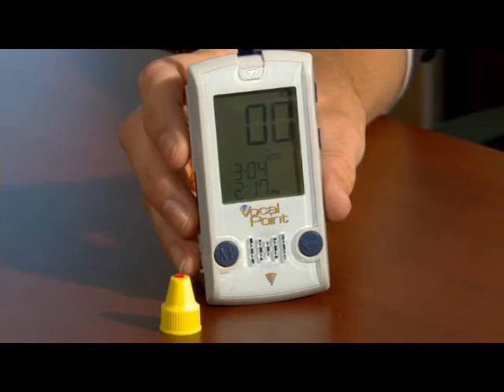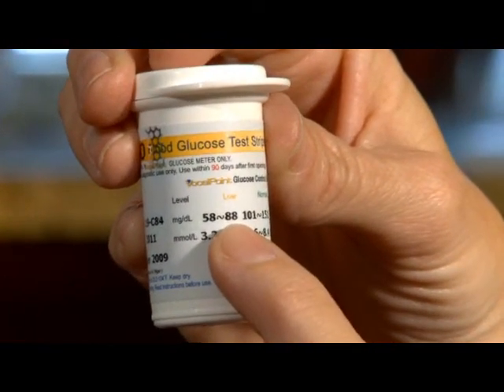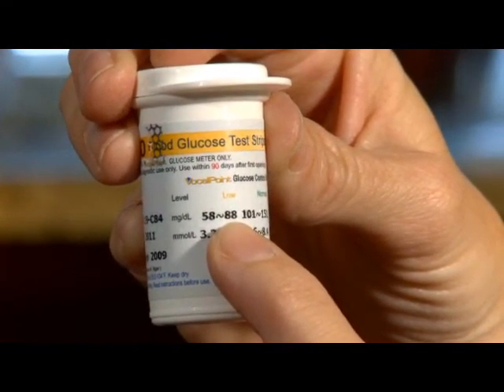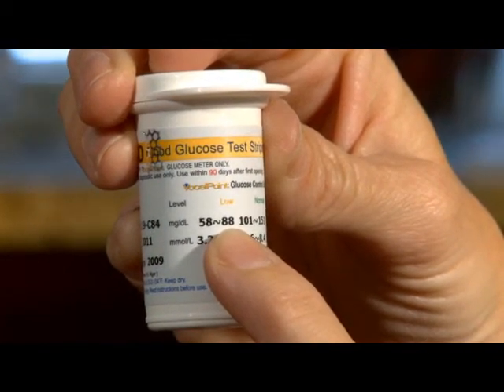The meter will count down from six seconds to zero and then will display the test result. Verify your control test results against the values printed on the outside of the test vial, keeping in mind which level you just ran. A result that falls into this range indicates that everything is functioning properly.